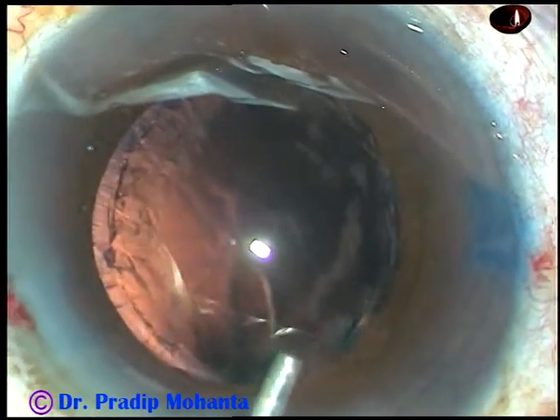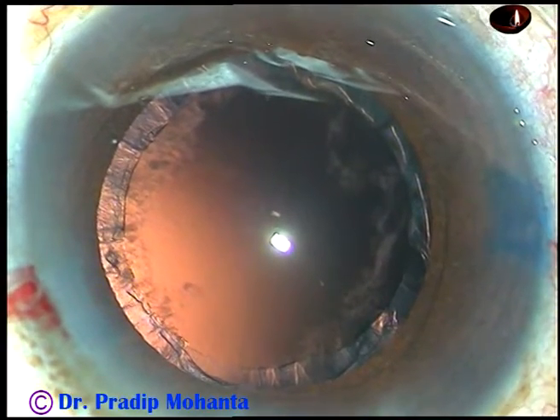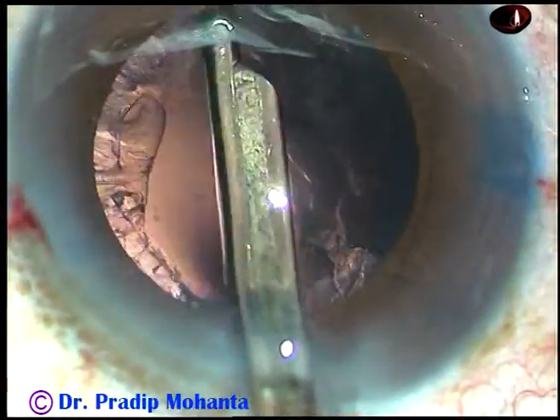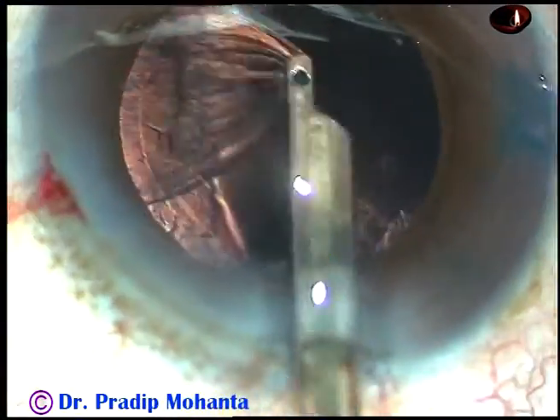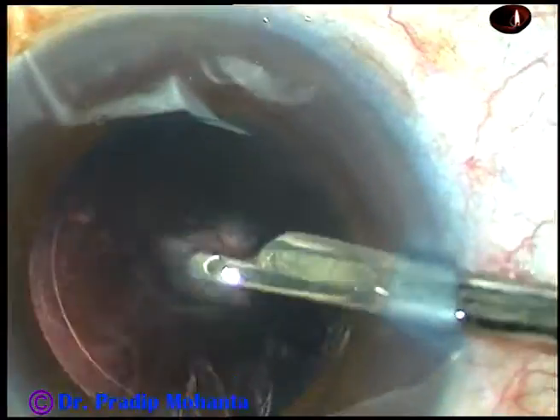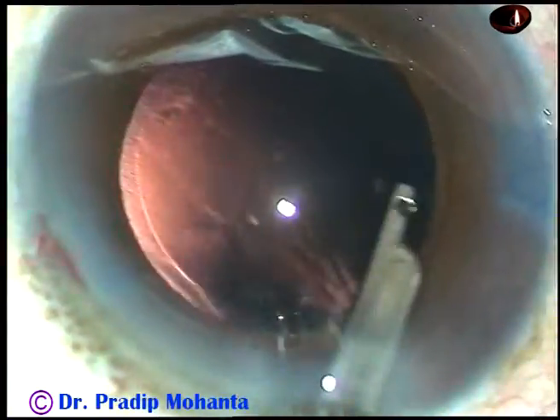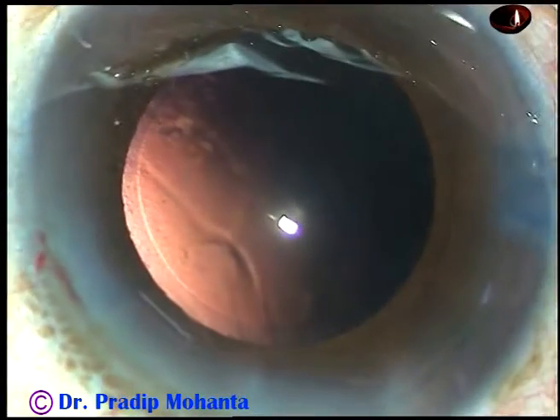And now cortical cleanup is to be done. Inject HPMC again. Take a 23-gauge Simcoe cannula and remove the cortical matter in a few seconds. Simcoe is just like coaxial irrigation-aspiration. We can manage with one site port if we use Simcoe. So cortical cleanup is done and a little bit of polishing of the posterior capsule is also done.